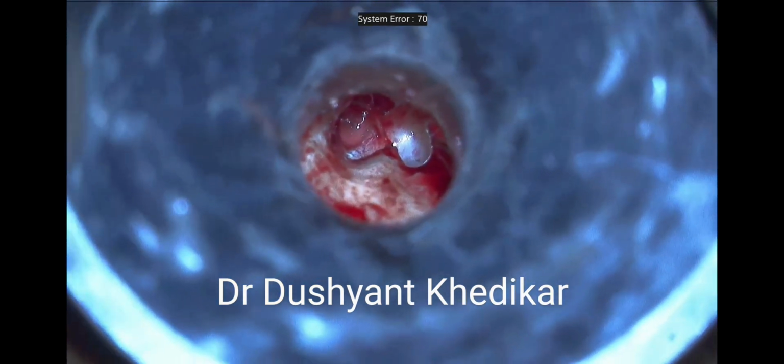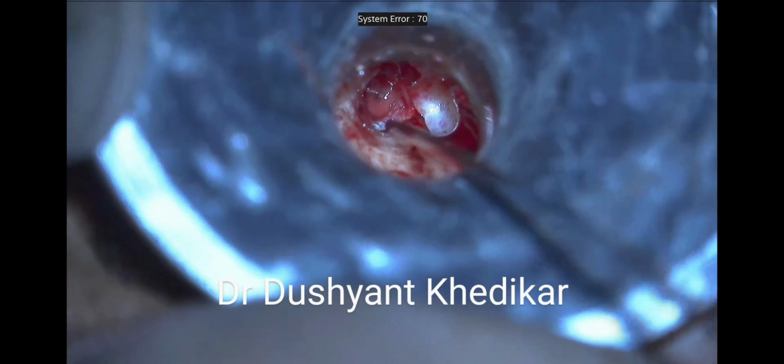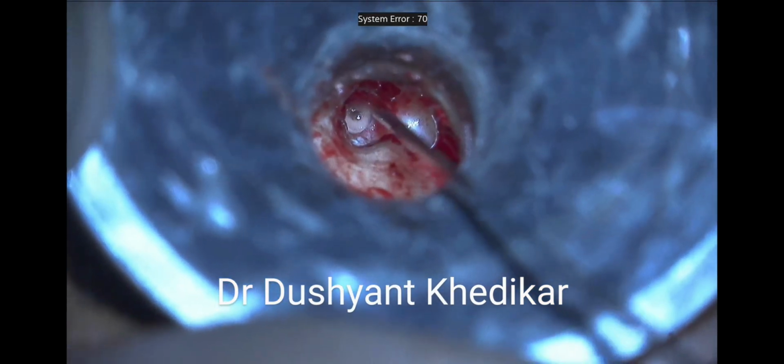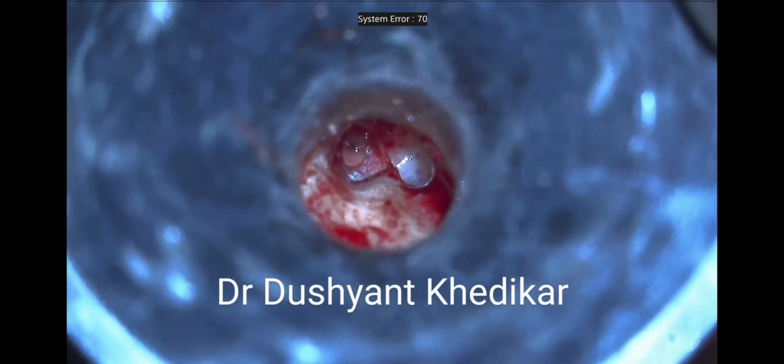Once adequate saucerization is done, a bony fenestra is made at the desired site, preferably in the posterior quadrant or the posterior quadrant and the middle quadrant, depending on the location of the incus. The bony fenestra is made without damaging the endosteal layer. Here you can now notice the formation of bony fenestra.